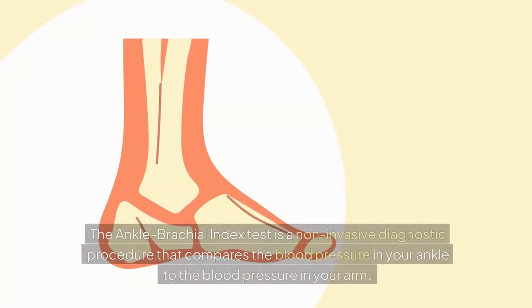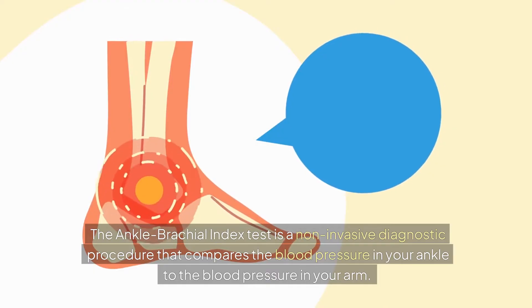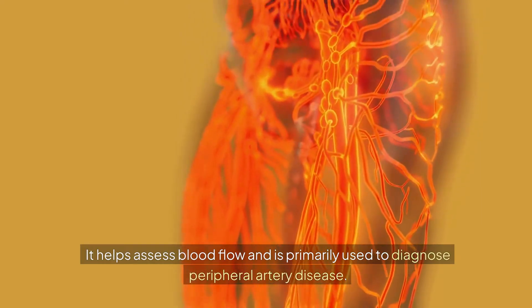What is an ABI test? The Ankle Brachial Index Test is a non-invasive diagnostic procedure that compares the blood pressure in your ankle to the blood pressure in your arm. It helps assess blood flow and is primarily used to diagnose peripheral artery disease.